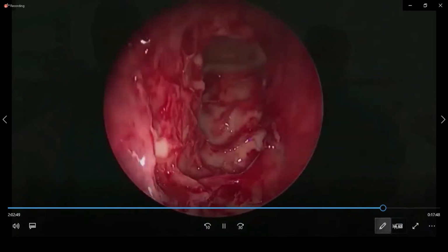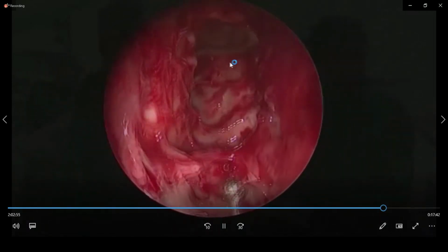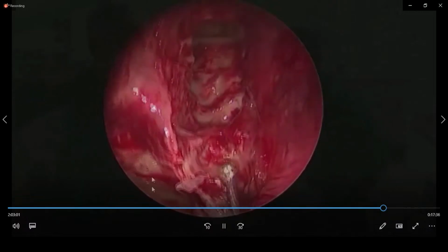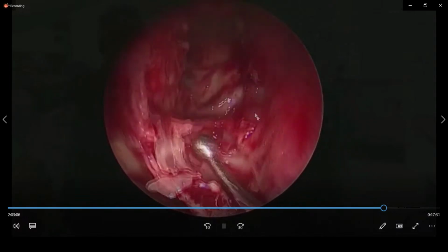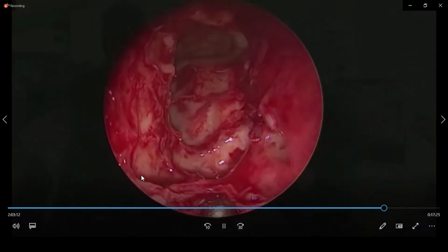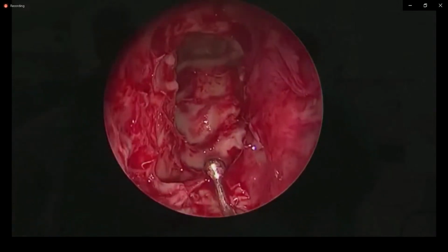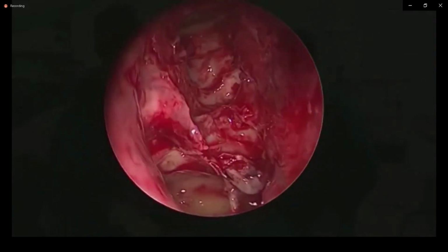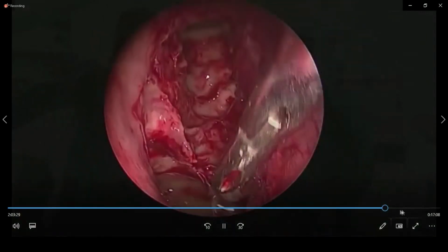No worries, sir. So now this is the end. What we have done so far is the maxillary sinus, frontal sinus, anterior ethmoidal skull base. This is the anterior ethmoidal artery. Now what is left behind? This is all done staying anterior to the ground lamella. What you see here is the ground lamella. And all those cells and the sinuses behind are the posterior group of sinuses. So far the anterior face is done. See my limits: the turbinate, the lateral wall, the maxillary sinus, the frontal sinus, the anterior ethmoidal artery.